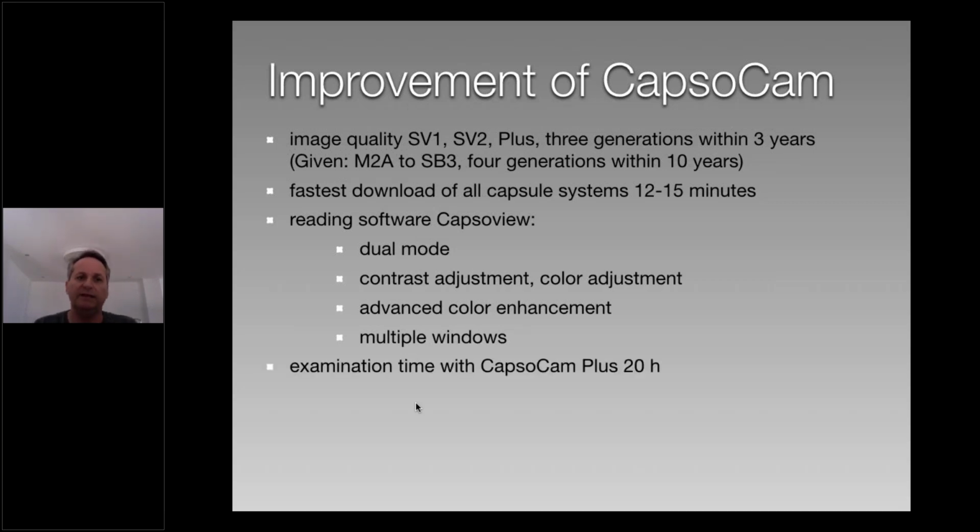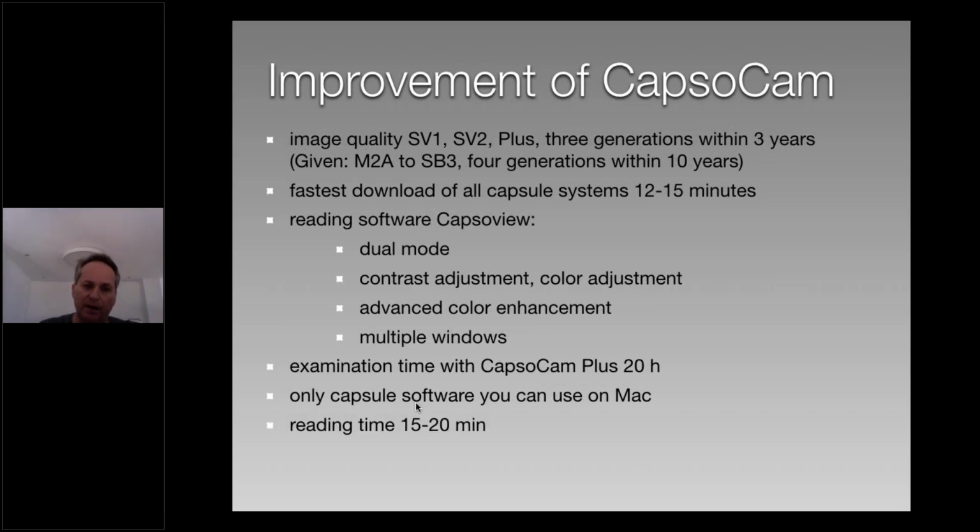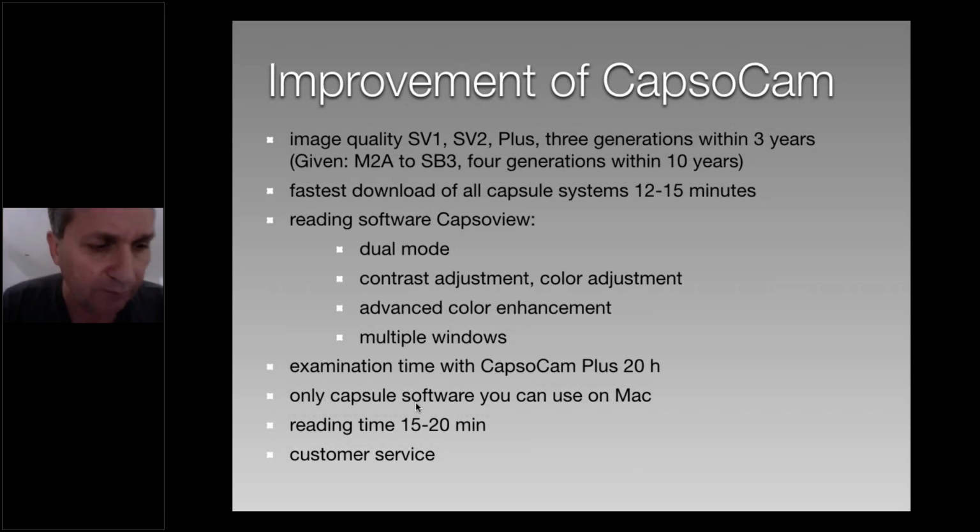We have the examination time with the CapsoCam Plus up to 20 hours. And it's the only capsule software you can use on Mac. An excellent reading time of 15 to 20 minutes because of the intuitive software. And we have a great service from the company. So even if there is a problem, it will be solved in a really short period.